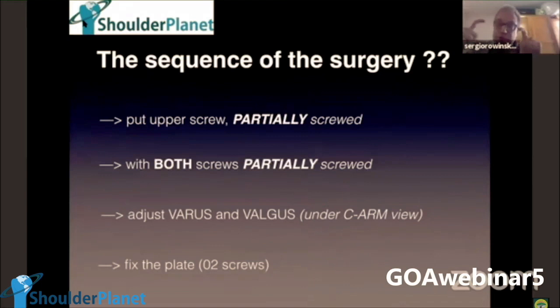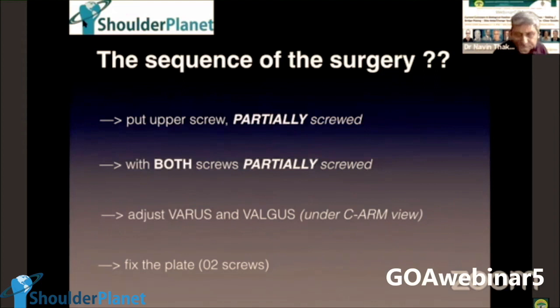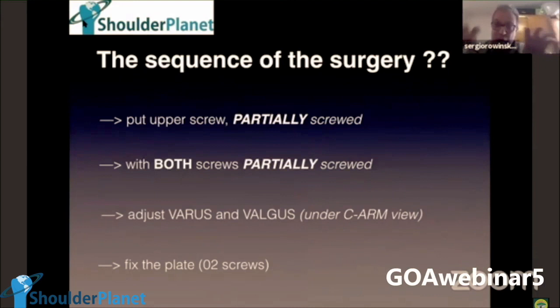One is keeping guidance. He's adjusting the varus and valgus and holds with both hands, and a third surgeon locks the two screws. So we need six hands to do this technique. This is something that is absolutely clear for us. Two people is a mess, is a tragedy, is catastrophical. In my opinion, it's impossible.